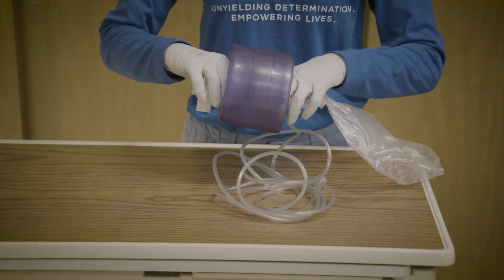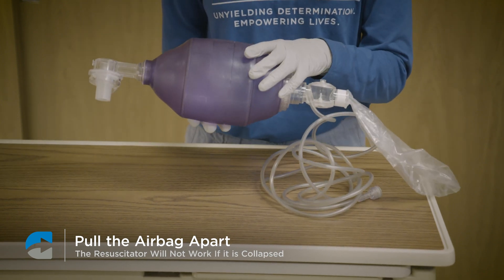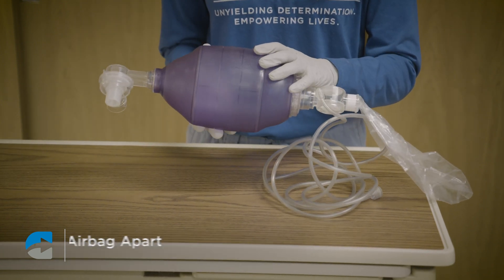Before using the manual resuscitator, you must first pull the airbag apart. The resuscitator will not work if the bag is collapsed.